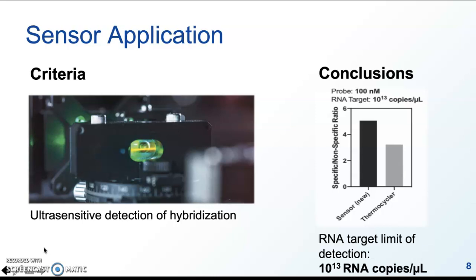Because fiber optic waveguides are made up of a material with a high refractive index, coupled light can propagate through the waveguide to generate an electromagnetic wave and excite the molecular beacon fluorophores for ultrasensitive detection. So, when the molecular beacon binds to the target, the fluorescent signal will be detected immediately by the sensor.